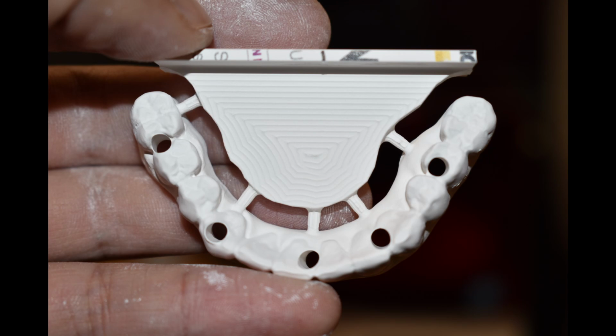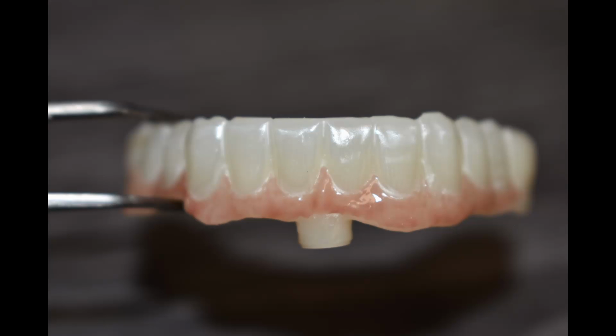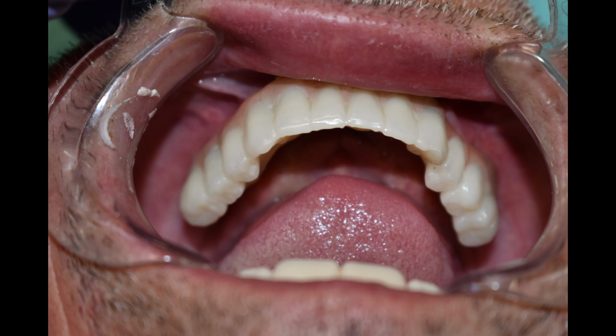This chalky white substance will then go into an oven and get baked and shrink down and turn into a tooth-looking color like this. Super dense material. I'll apply a layer of stain to the gums so that it looks somewhat lifelike, and then we're ready to install it on top of the implants. There are 5 little screws that poke out the bottom, and they just get screwed onto the implants, which I'll be showing you for the upper in this video.